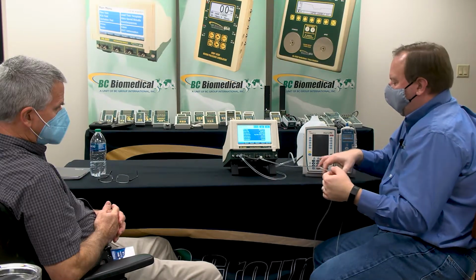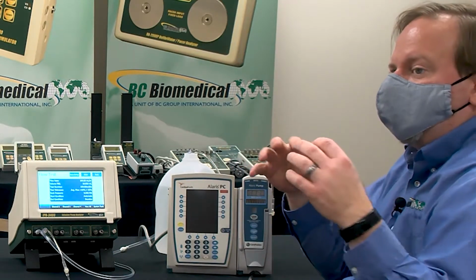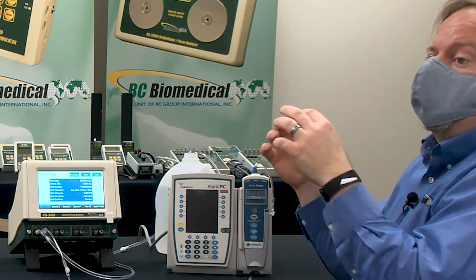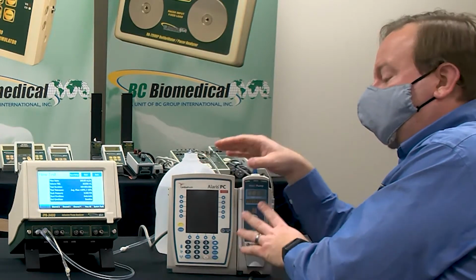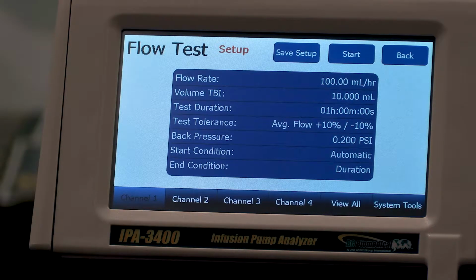The back pressure, that is the pressure that is seen by the pump. Because we have control inside, we have those syringes and we measure pressure. So once the pressure gets to this value, we start moving. And we say, okay, well, there's incoming flow. The monitor may have a specification that says it will pump into 200 millimeters of mercury, whatever the pressure is. We can set this up for millimeters of mercury if they want to do that, or we can say we want 0.2 psi, that's great. So anytime the pressure gets above that, it's going to start flowing and measuring the flow.